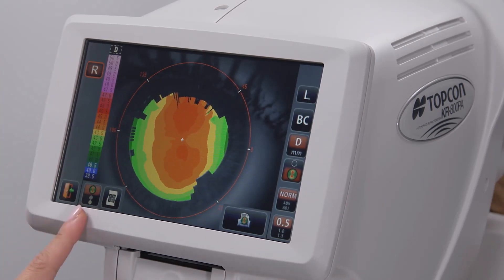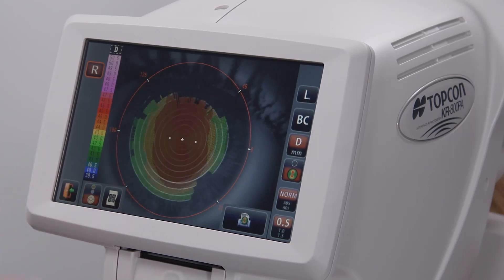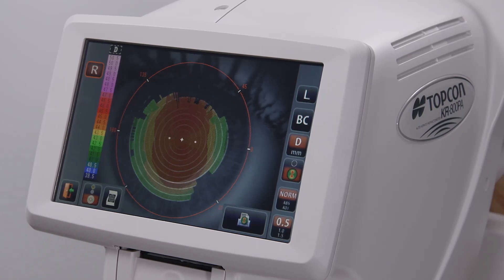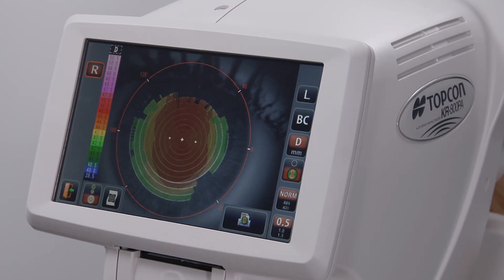The mapping display icon allows the operator to switch between a solid corneal mapping overlay, no overlay, or a semi-transparent overlay. The mapping target print icon prints images of just the Placido disk rings on the corneal tear film. The print icon will print the corneal mapping information.